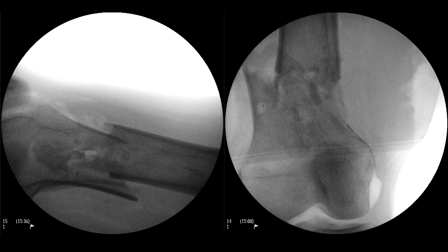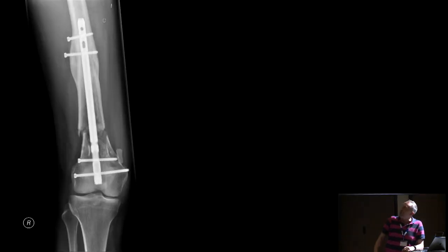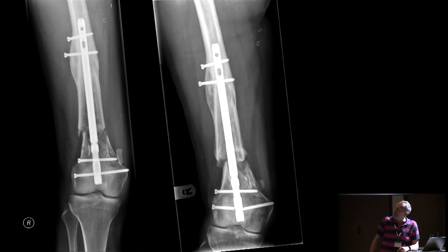Again, I've not quite got to the bottom of how that happened. I think they maybe didn't remove one of the locking bolts when they were trying to remove the nail. But for whatever reason, she suffered this comminuted distal femoral fracture intraoperatively. It was stabilized with a short retrograde femoral nail on the table before they woke her up. To do so seems reasonable. I'm not sure it's an implant I would have chosen for that. Following this, she was kept in bed for quite some time, but despite that, this was the outcome.